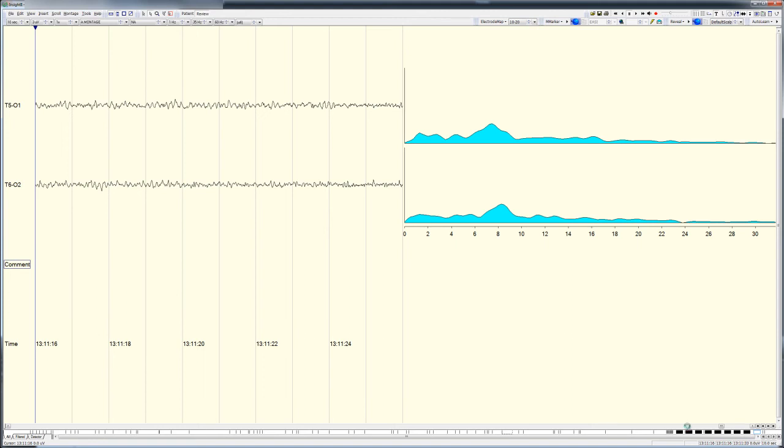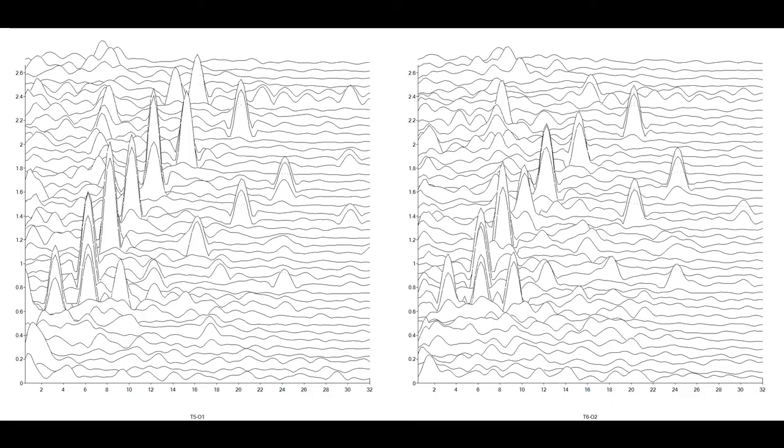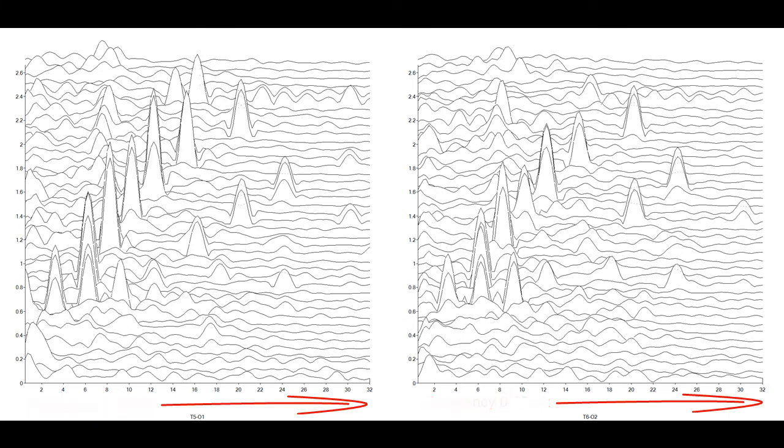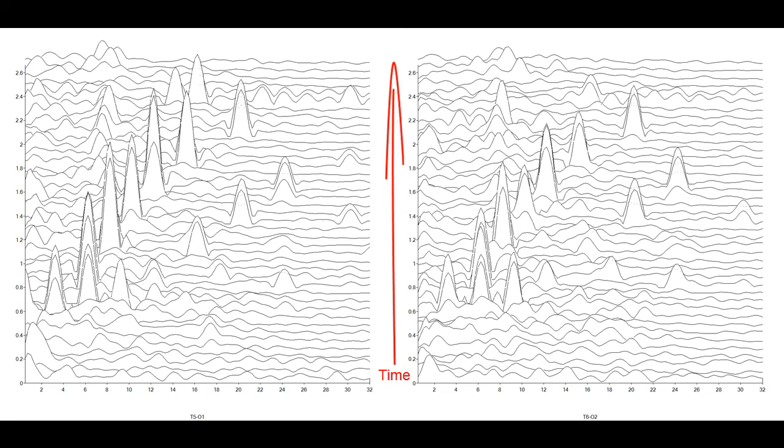A more easily appreciated representation of the FFT spectra can be created by stacking the FFT line graphs one behind the other slightly offset to create a 3D-like graph called a Hidden Line Compressed Spectral Array, or CSA for short. Here I've shown the FFT spectra from successive 4-second EEG epochs obtained over about 2.5 minutes of intermittent photic stimulation.